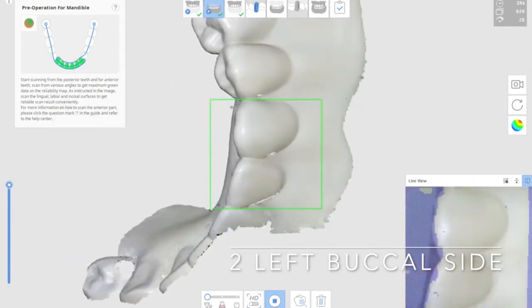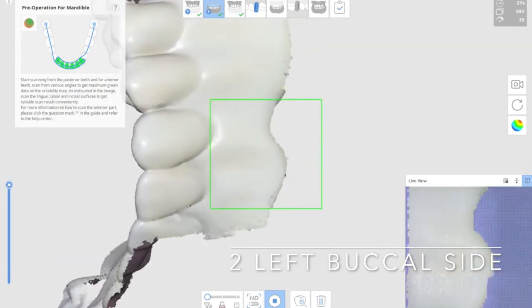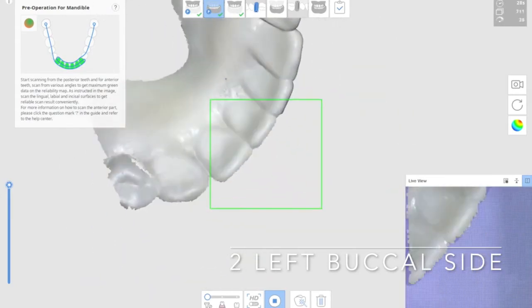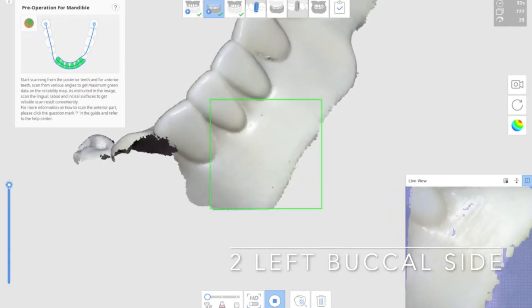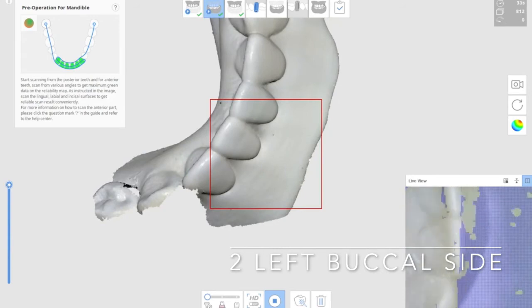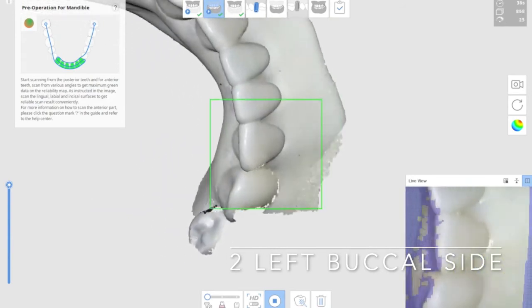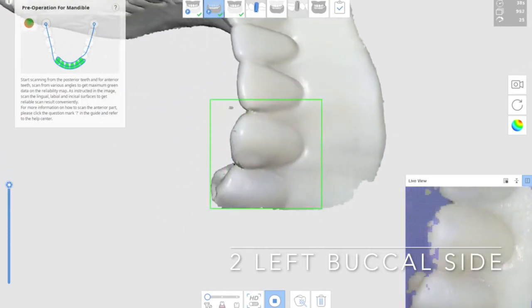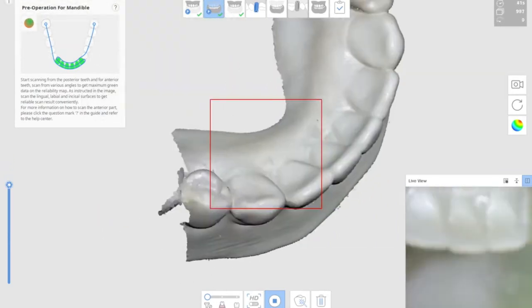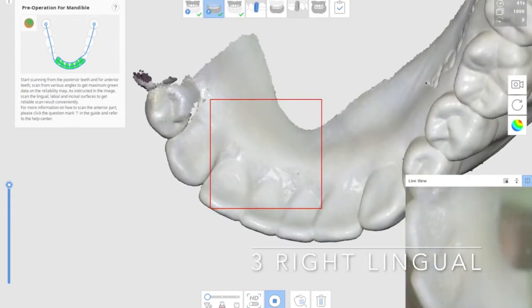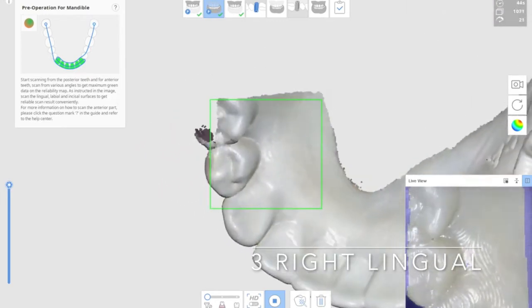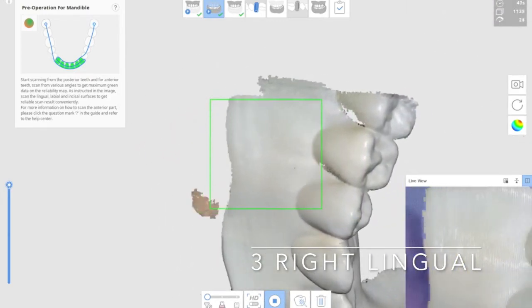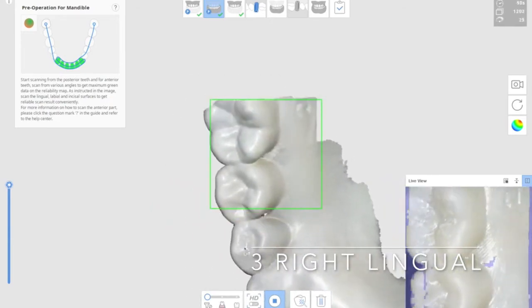And the left buccal side, same as edentulous model scanning. Left lingual side and the second one is left buccal side. When you scan try-in model, it's good to start from the teeth so that it lets the computer understand where you are holding the scanner. Then you are moving on to the right side lingual side surface by covering the entire denture teeth.